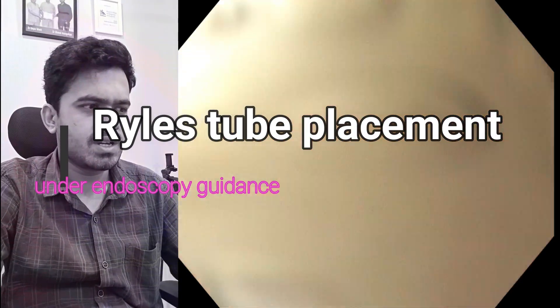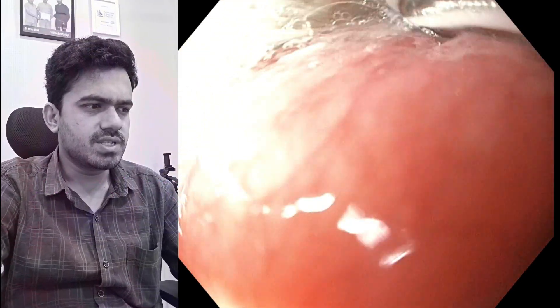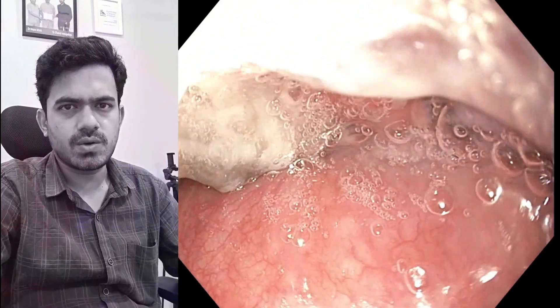Hello everyone, this is Dr. Gnash, and today we'll be seeing how we insert a Ryle's tube in a patient who cannot swallow.